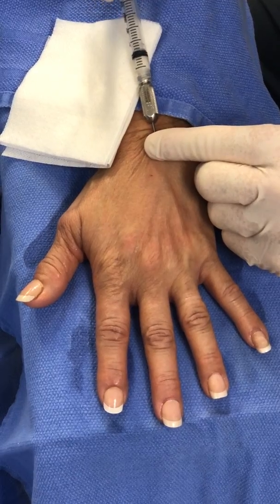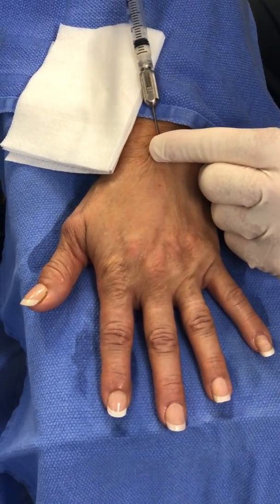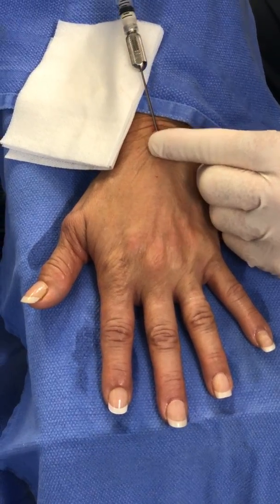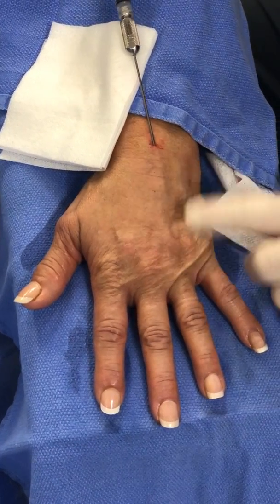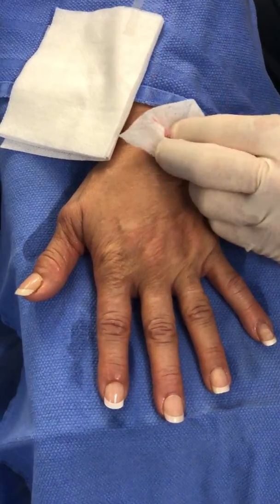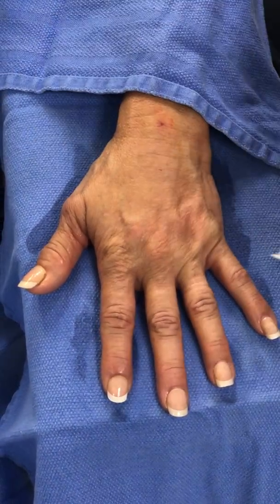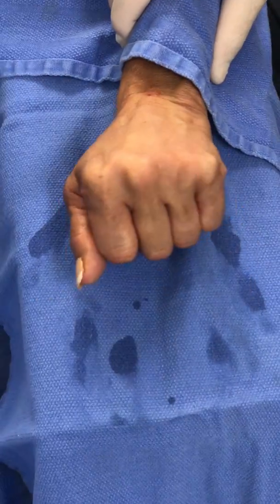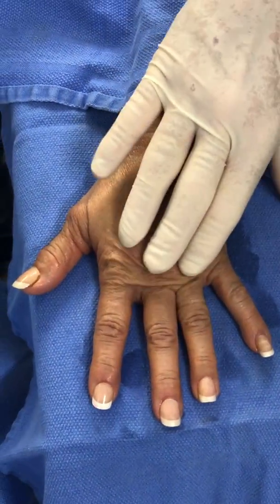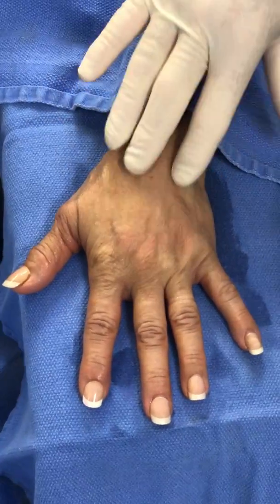And then we're going to come back between the tendons — I want to fill in between the tendons. Before I put my other syringes in, Bonnie, I want you to make a fist for me. And then that'll help spread that adipose matrix between the tendons.